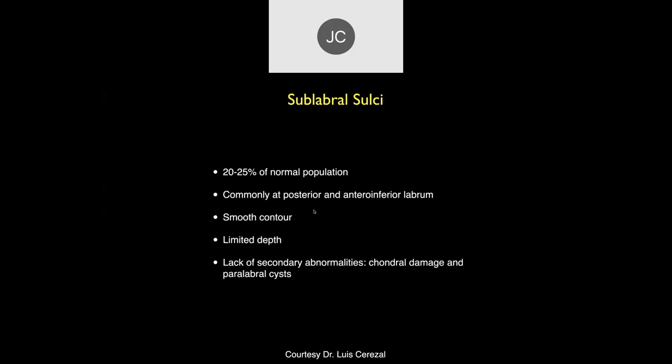If it's nice and smooth, I'll describe it as a congenital chondrolabral defect or sublabral sulcus. But I usually say in the report that this is thought to be a normal chondrolabral congenital defect, though a tear cannot be entirely excluded.